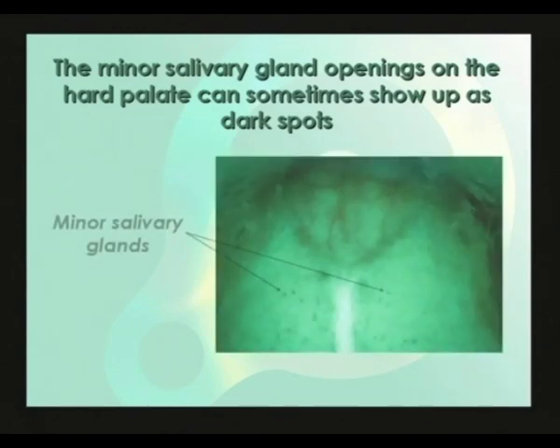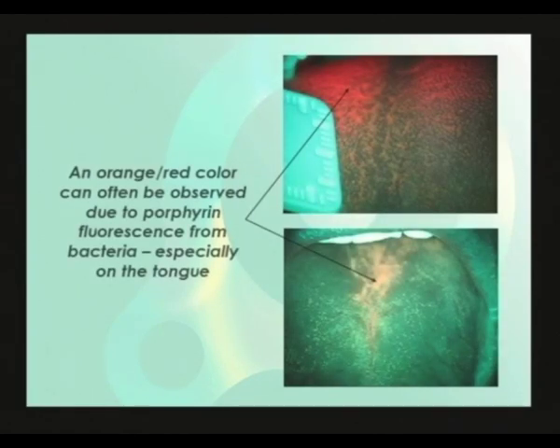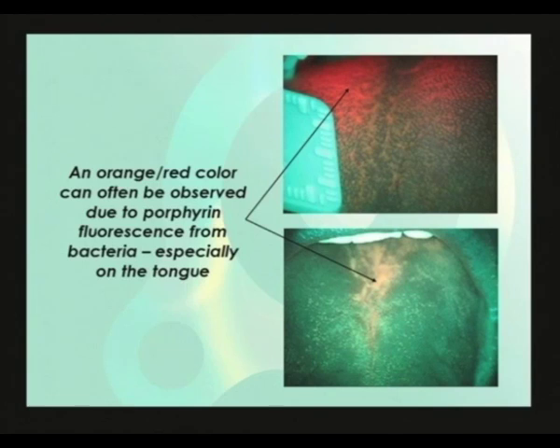The minor salivary gland openings on the hard palate can sometimes appear as dark spots when using Velscope. Here we see two examples of the orange-red color from porphyrin fluorescence generated by bacteria. The tongue is the area in the mouth where this is most commonly observed, as it is quite common for bacteria to get trapped amongst the carpet of filiform papilla or in the fissures that can sometimes develop, as can be seen in the lower photograph.